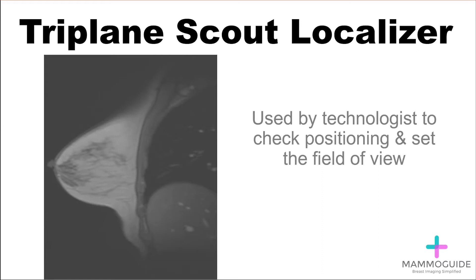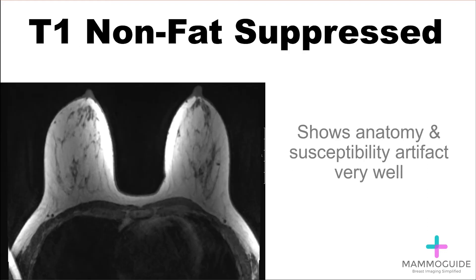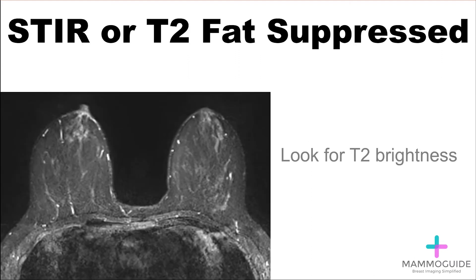The triplane scout localizer is used by the technologist to check positioning and set the field of view. Next, a T1 non-fat-saturated sequence can be used to show the anatomy and also show susceptibility artifact very well. Biopsy clips and surgical changes jump out on this non-fat-saturated sequence.